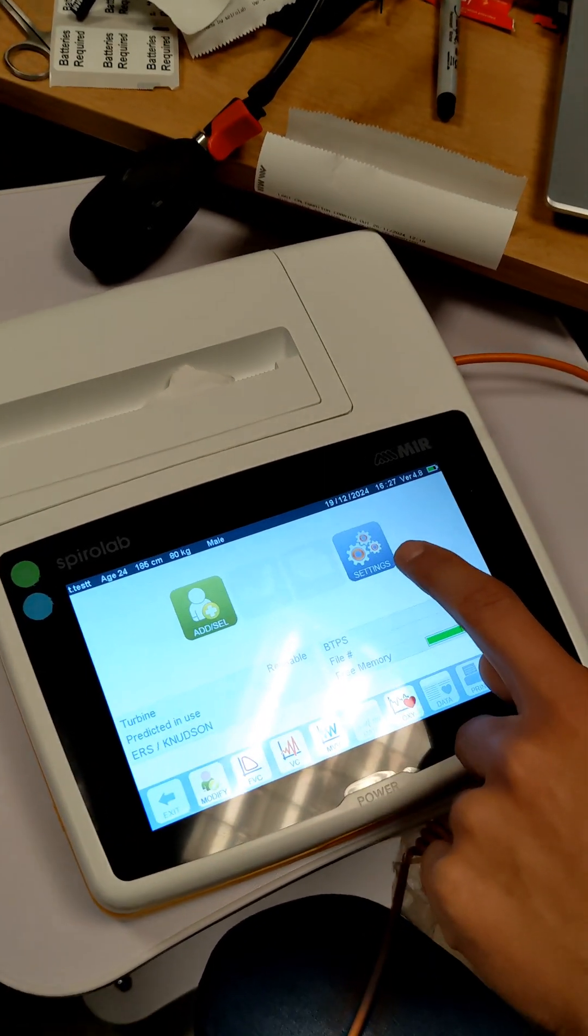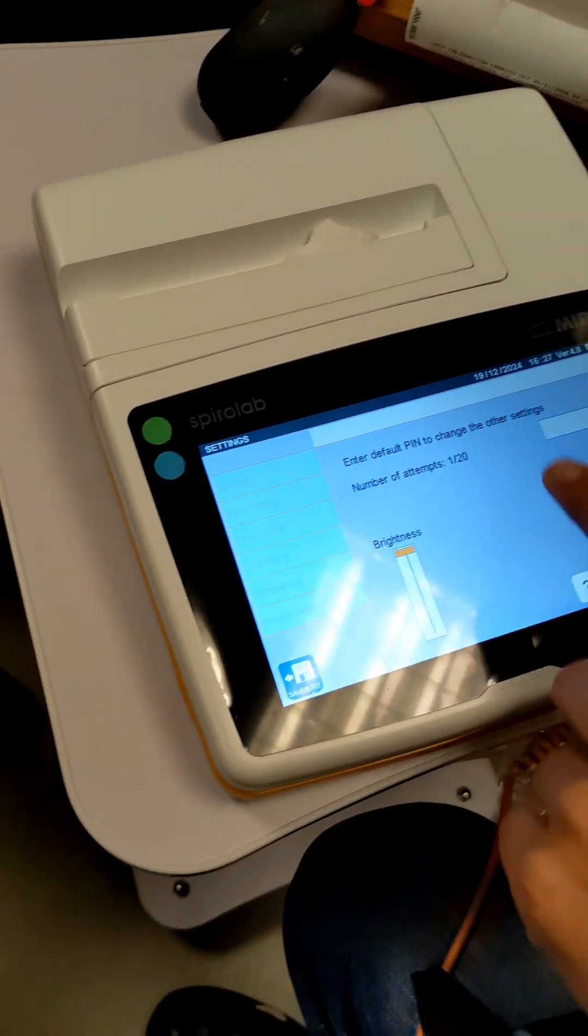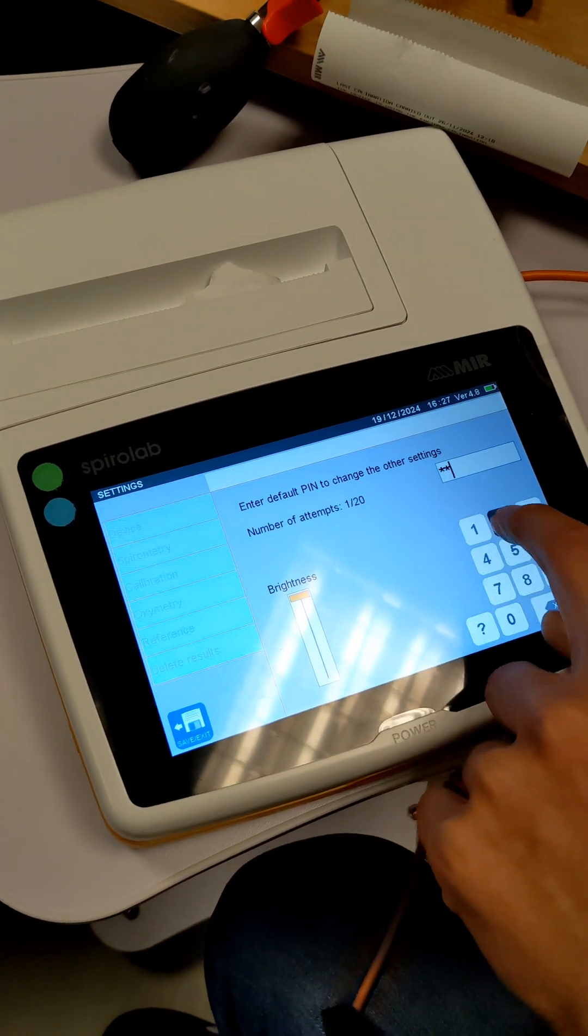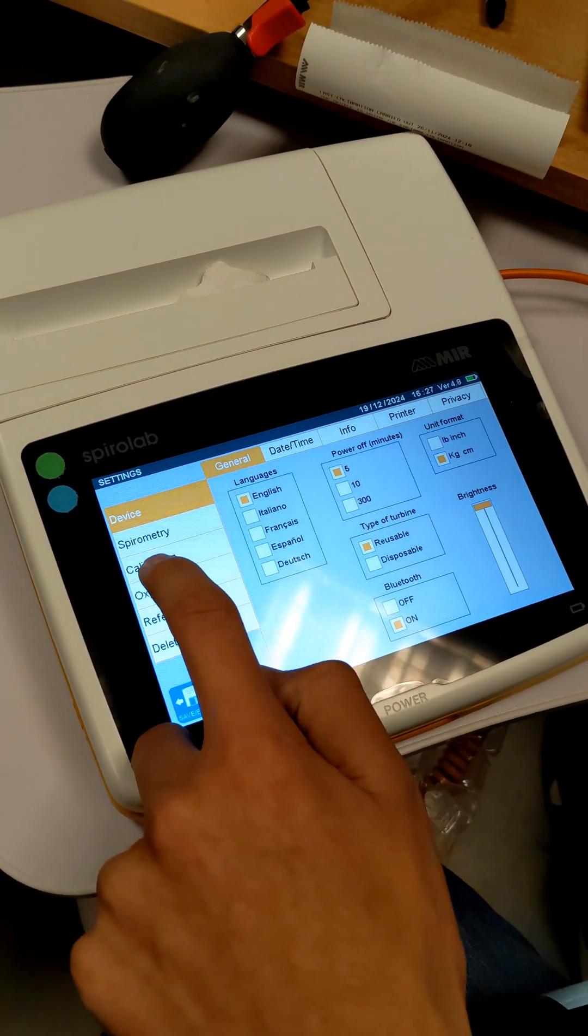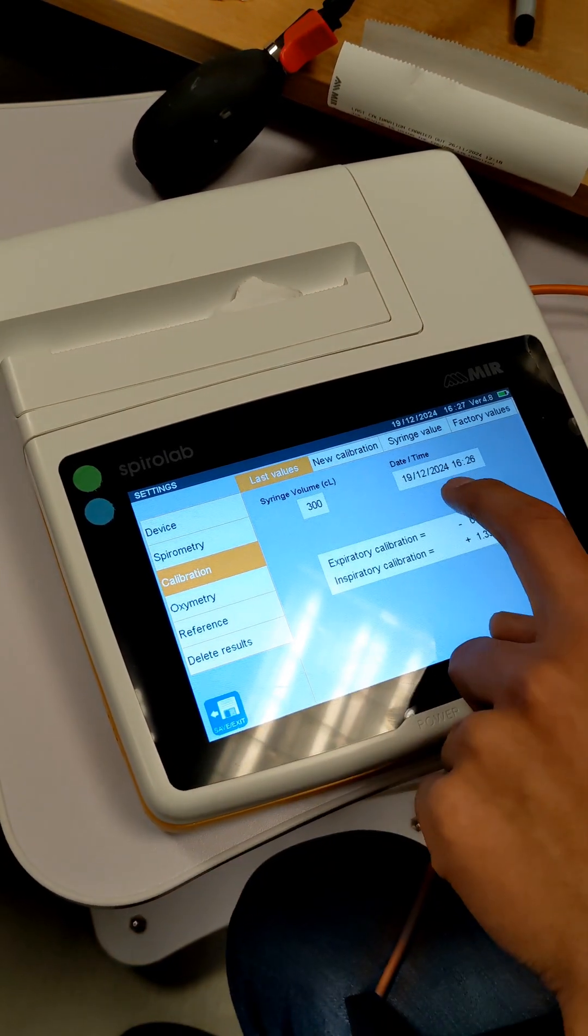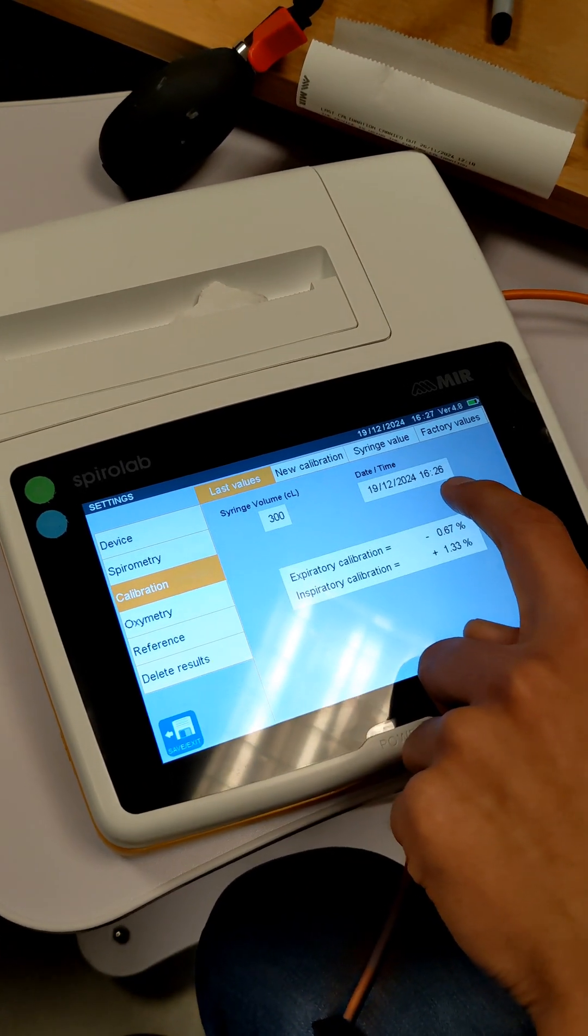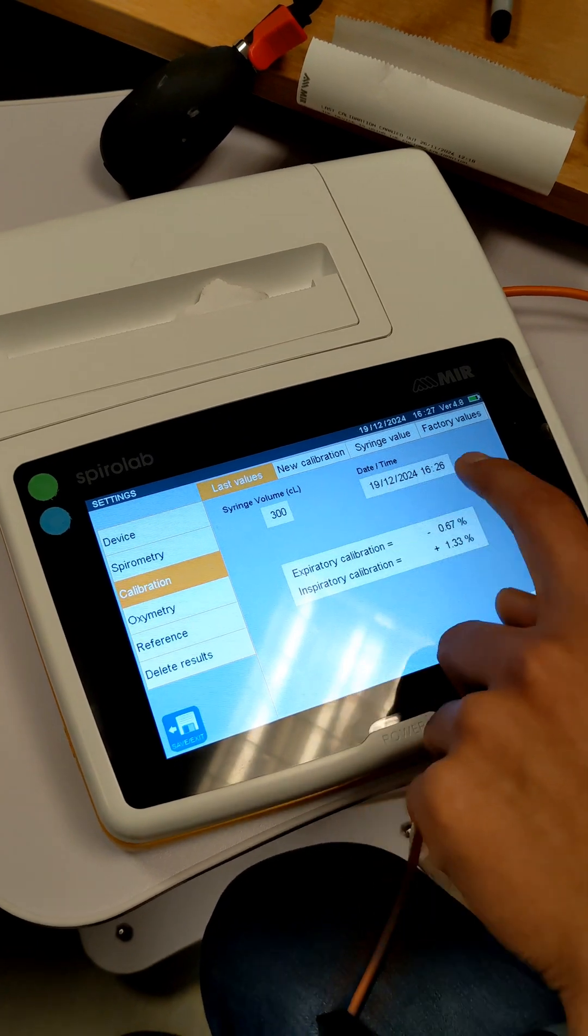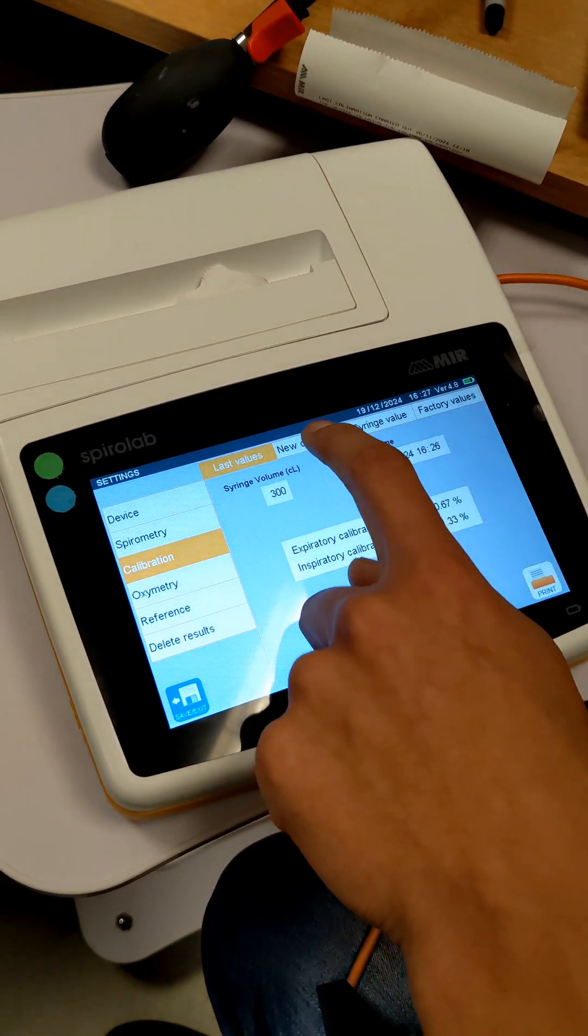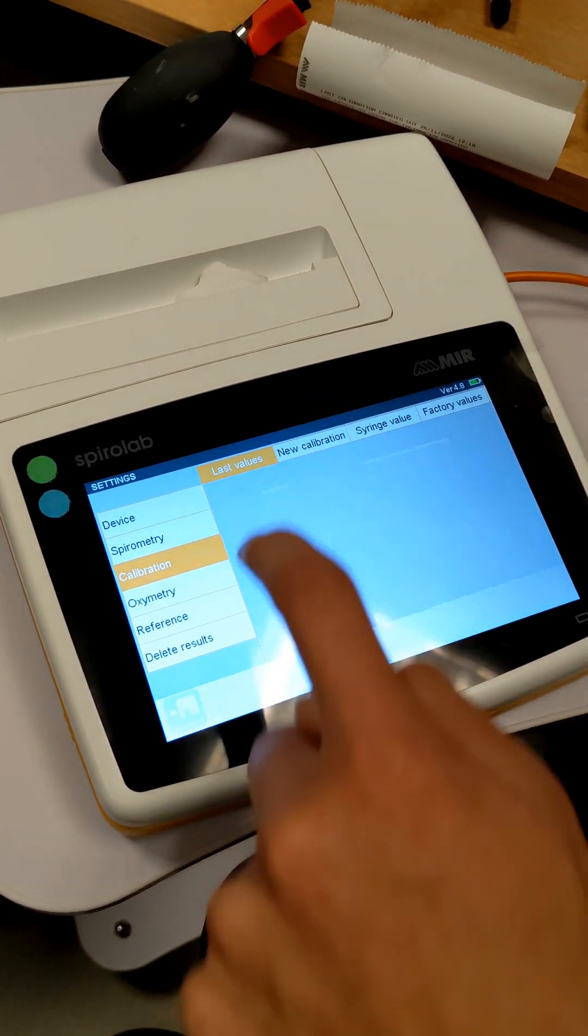You've got the settings button. You enter the same pin 1223. It's got an option here for calibration. This date here shows when it was last calibrated. So we've just done this, but if you want to calibrate it again, you press new calibration.